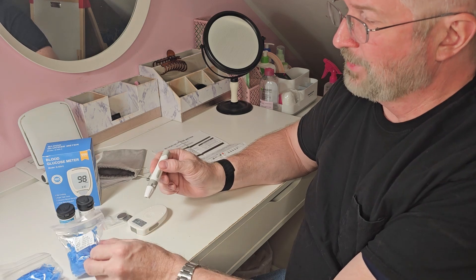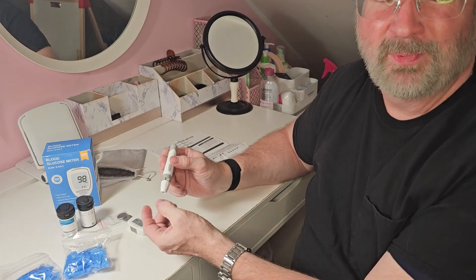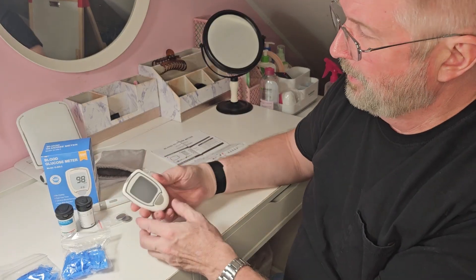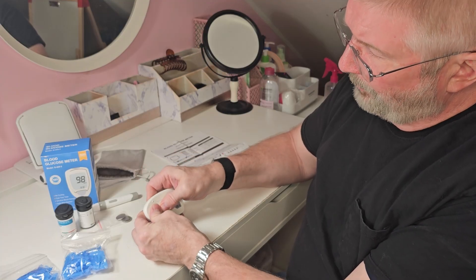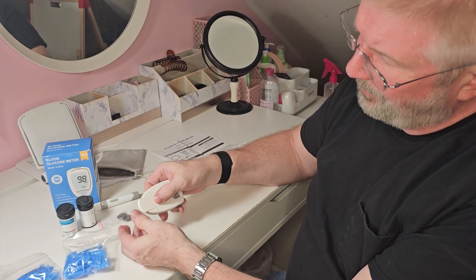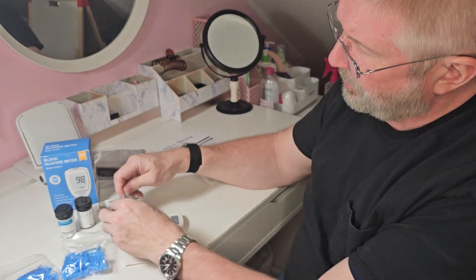This is a lancet device, and this is what the lancets go into to basically poke a hole in your finger so the blood comes out. This is the meter, and then you open up the back — you've got to push down and move out — and it does come with batteries.